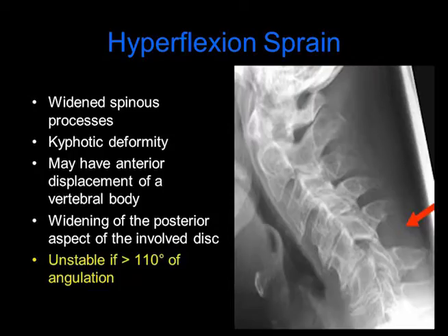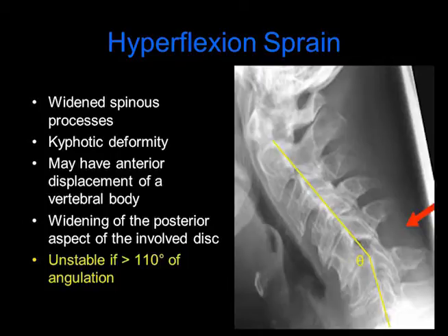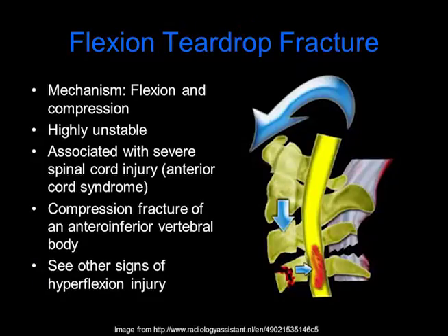With a hyperflexion sprain there are widened spinous processes, as we can see in this radiograph with the red arrow. As well, there is a kyphotic deformity which we can see with the yellow lines. You may have anterior displacement of one vertebral body on another, as well as widening of the posterior aspect of the involved disc. This is considered unstable if there are greater than 11 degrees of angulation.